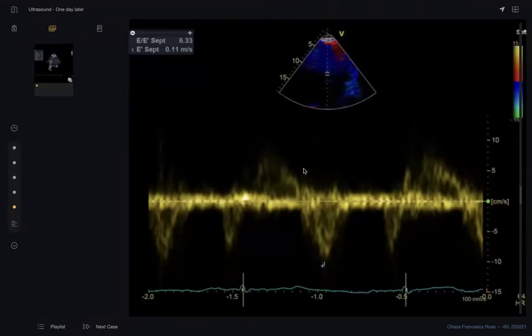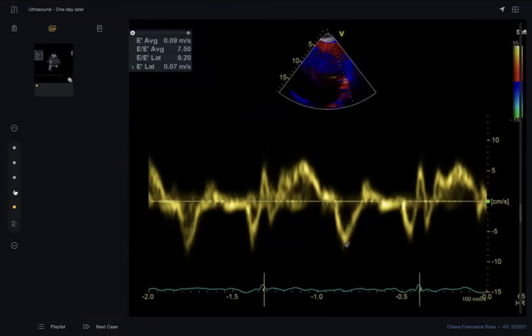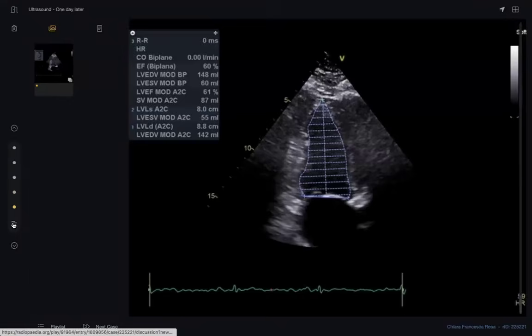As I think in my knowledge in echo, see this one. If you see flow like this in both sides, this means a shunt, as I know. Anyway, if you don't have any knowledge about echo, the examiner will just ask, and finally you can guess this.